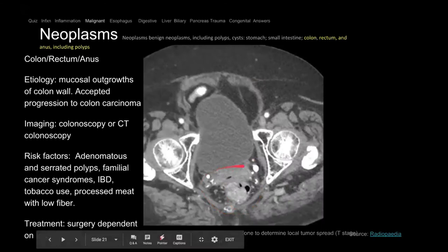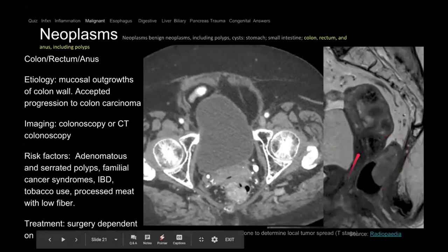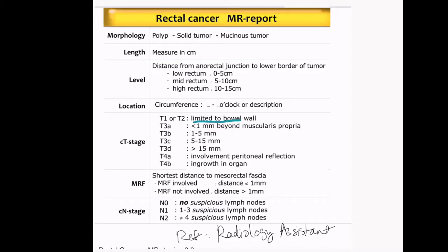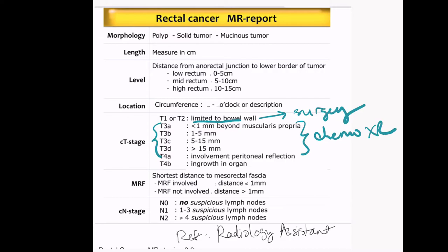Moving on to neoplasm. This is a CT pelvis and we see a mass in the rectum. This was the corresponding MRI rectum protocol done to look at the mass because they wanted to know the T-staging and spread. MRI helps determine if it's T2 versus T3 disease — T2 is treated with surgery, whereas T3 is treated with chemoradiation.